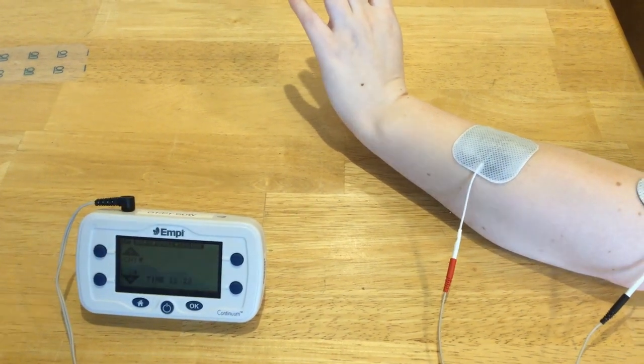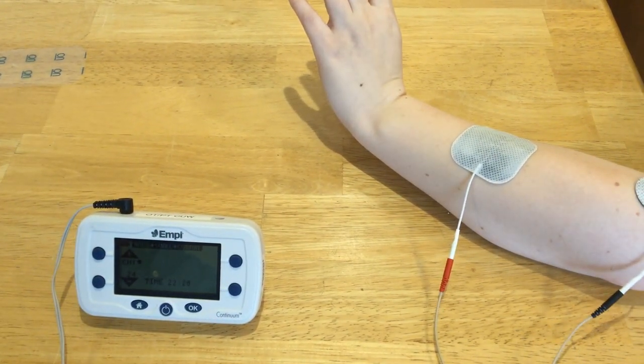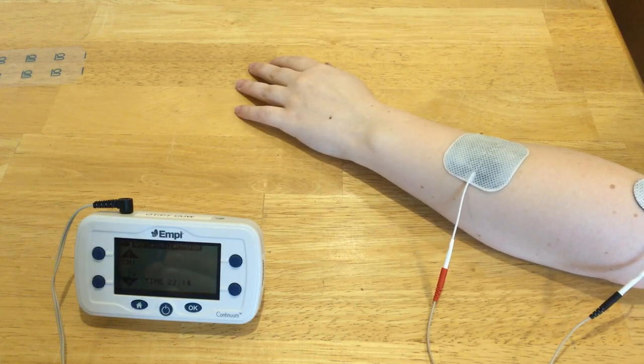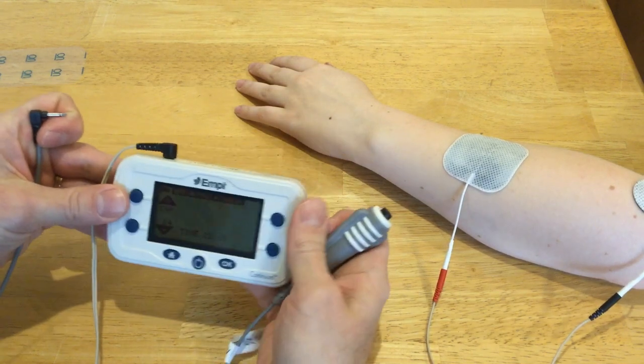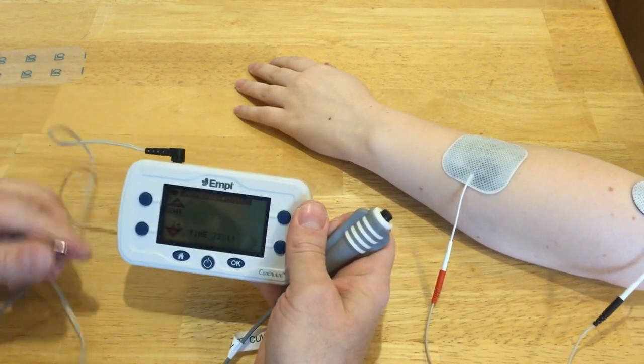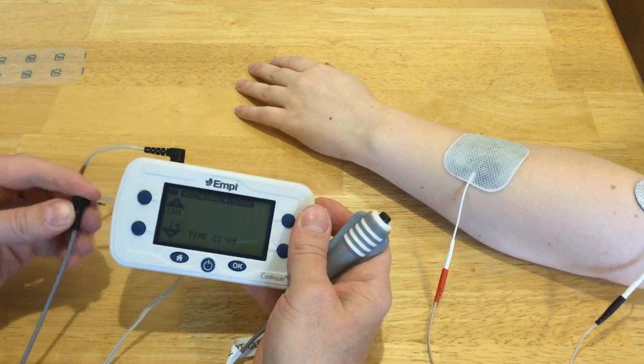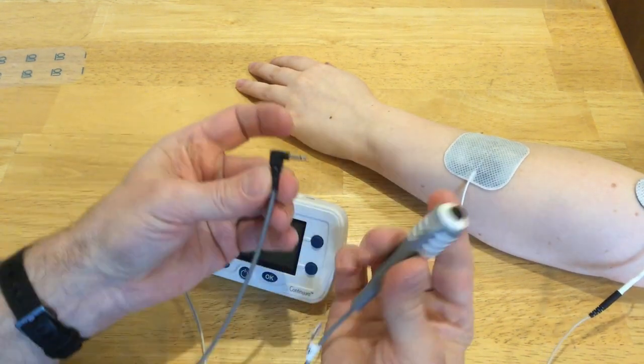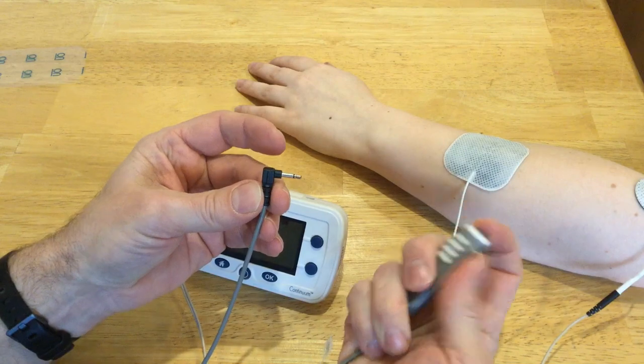Now I want to show you one other thing, now that we've found our radial wrist extensors. Let's pretend that my client had a radial nerve palsy and I wanted to selectively stimulate that radial nerve during functional activities. Here I have a switch — it's just an on-off switch.